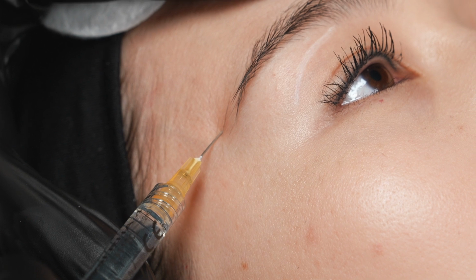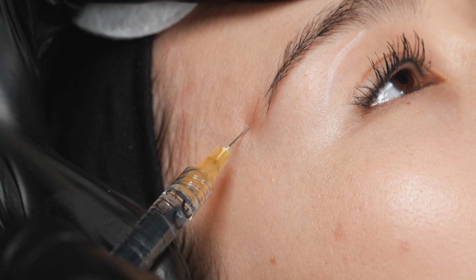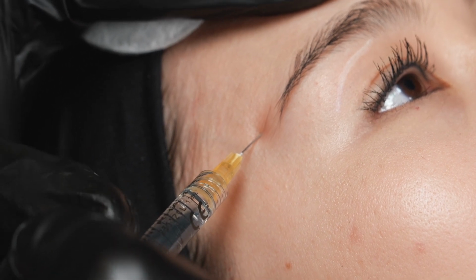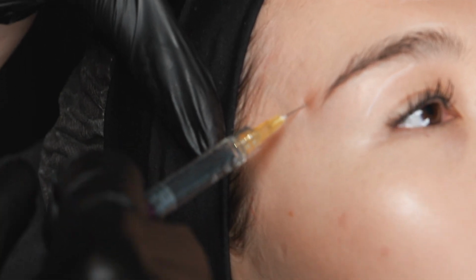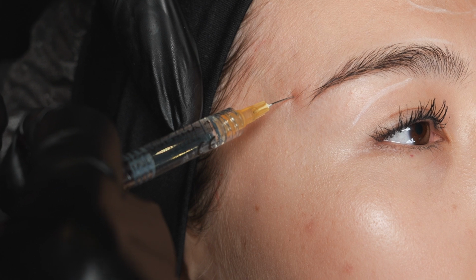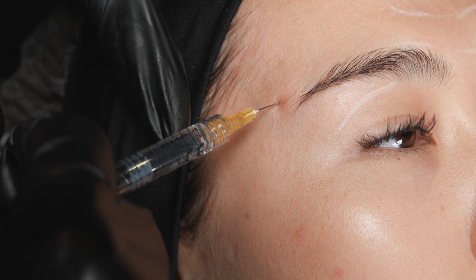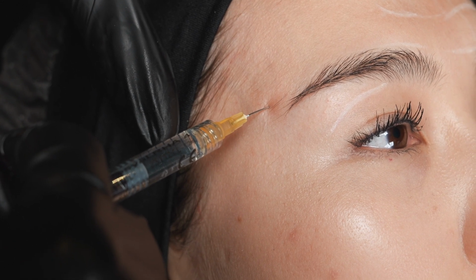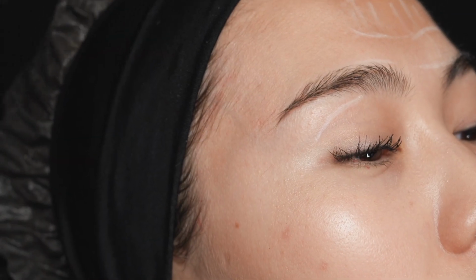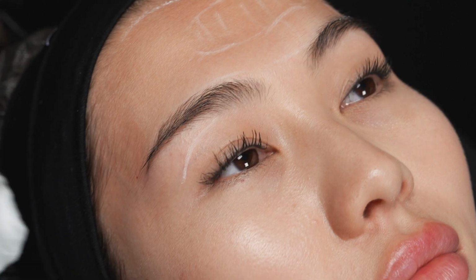Далее я стараюсь иглой быть под мышцей и начинаю медленно вводить инъекцию под минимальным давлением. Может быть, камера может показать, как я ввожу объем, чтобы продемонстрировать скорость введения препарата. Посмотрите, буквально минимально. Я не хочу дать слишком много объема этой пациентке, потому что ей не нужно больше 0,3-0,4, максимум. Давайте 0,4 сделаем. Это у нас RHA4, мягкий волюмайзер. Объем мы получим. Выхожу и немного расправляю препарат.